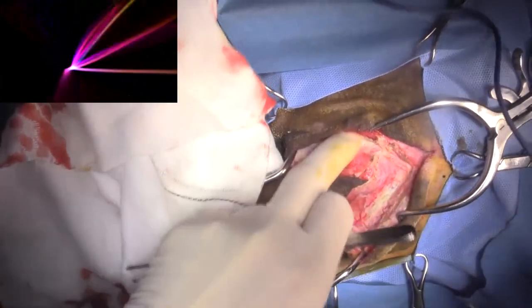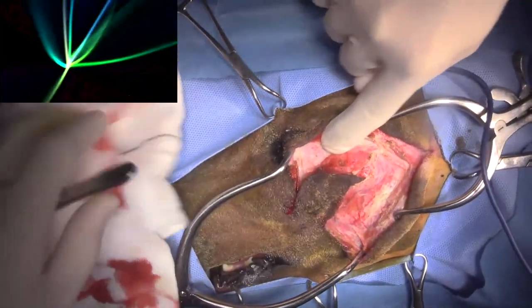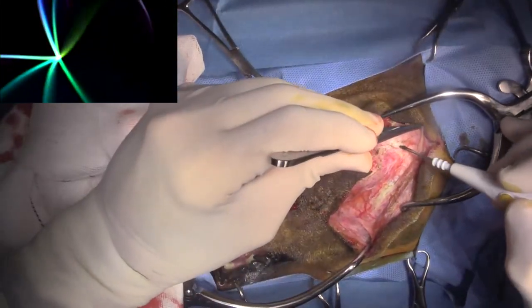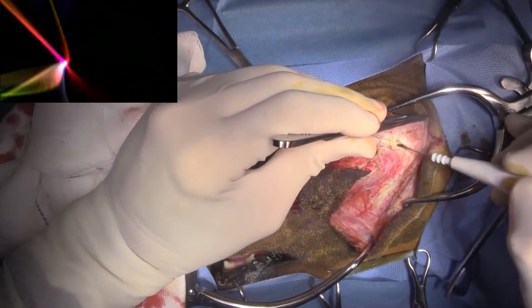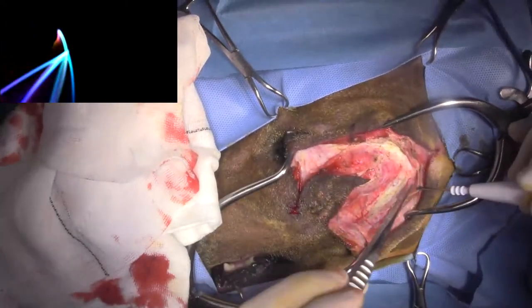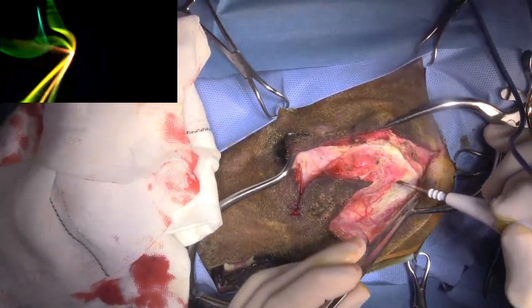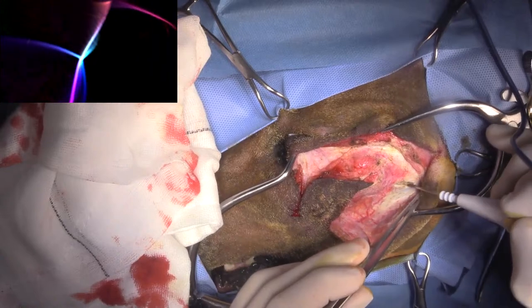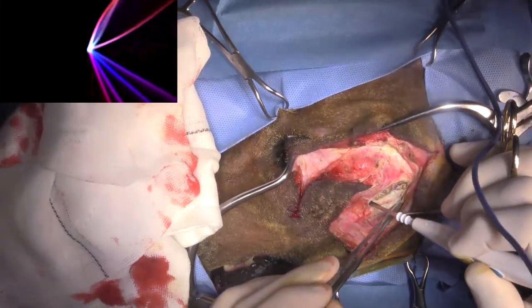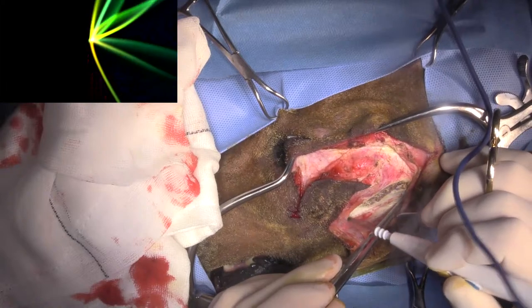You can feel that. You want to feel that? Not yet. Right there. I'm getting down to the zygomatic arch right here. And we've got the masseter muscle underneath it. I'm trying to get a little bit of a soft tissue margin at least.